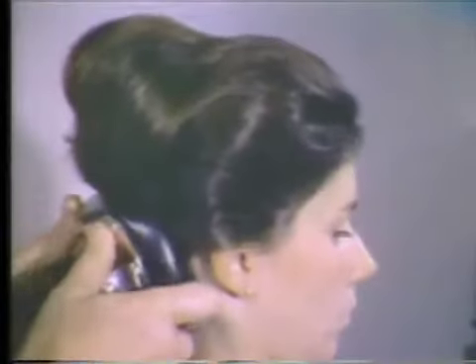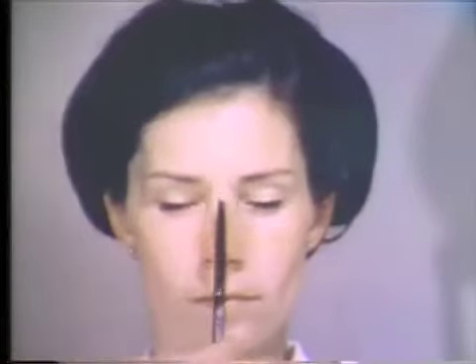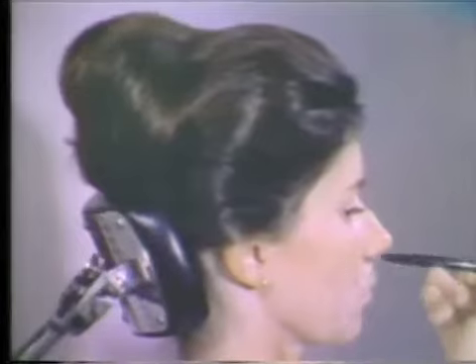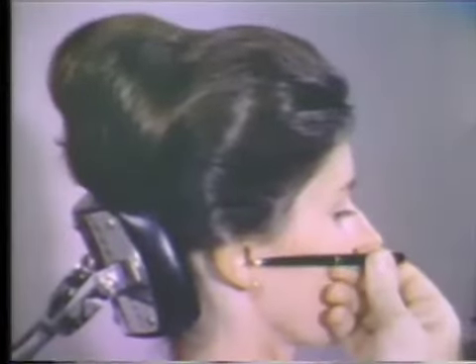Positioning the patient for the cross-section occlusal radiograph is similar to the other maxillary projections. In a frontal view, the mid-sagittal plane of the patient's head must be vertical. In profile, the head must be positioned so that the ala tragus line is horizontal.